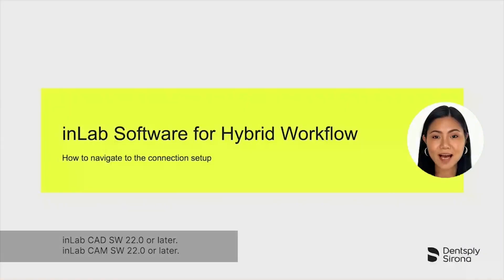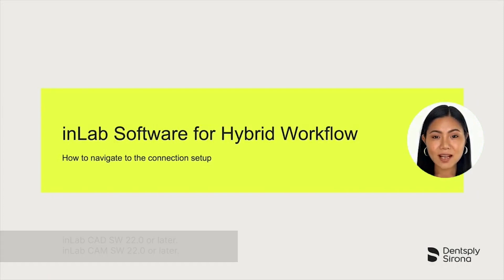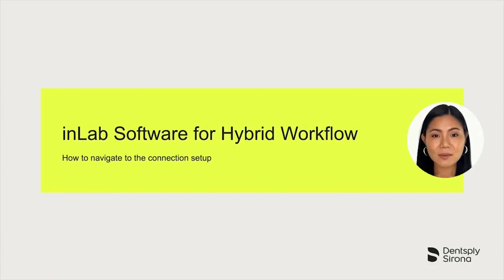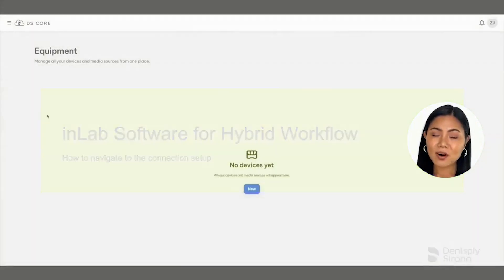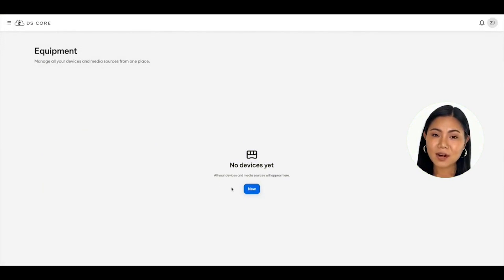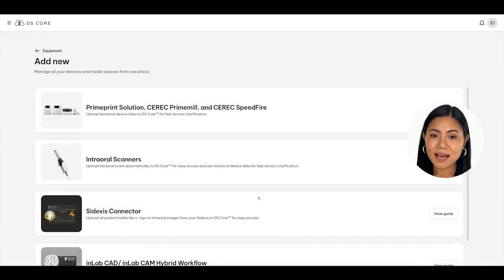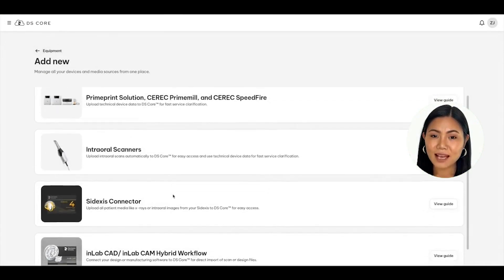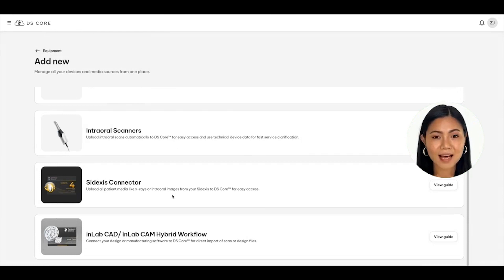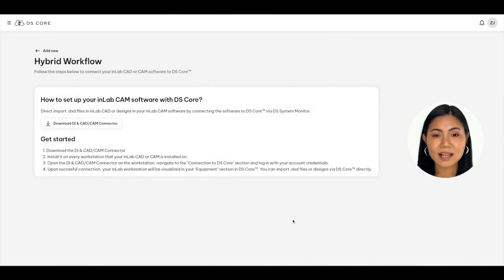To connect your InLabCAD 22.0 design or InLabCAM 22.0 manufacturing software so that you can directly import .dxd files or send files to be manufactured, open DSCore in a web browser on a computer running your design or manufacturing software. Navigate to your equipment list, click the new blue button, and then click on the white View Guide button located in the InLabCAD/InLabCAM Hybrid Workflow section. A set of instructions will appear on how to start connecting your software.